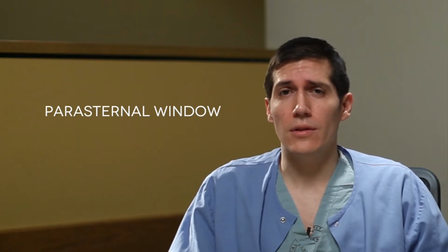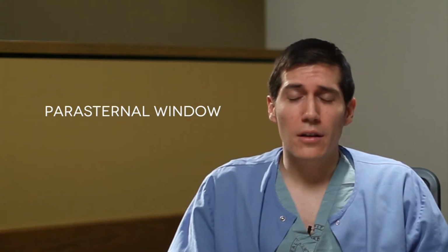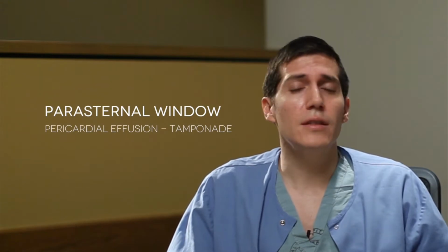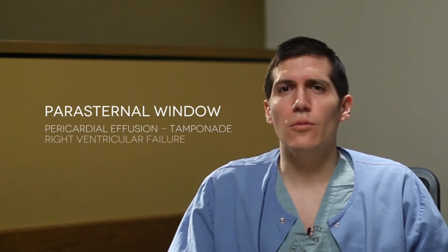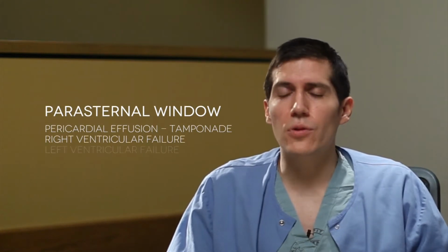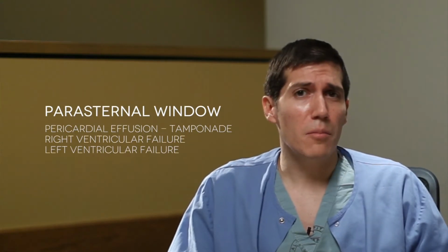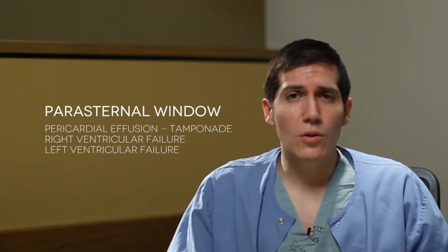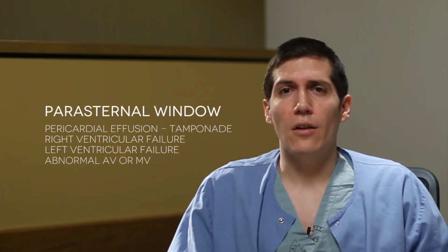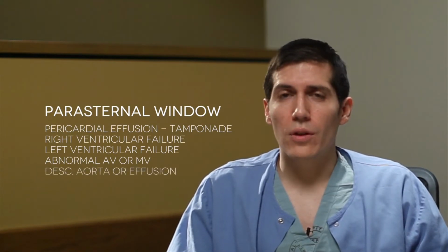to a quick diagnosis. The diagnoses we're considering for an unstable patient in this window would be pericardial effusion leading to tamponade, right ventricular failure with an enlarged right ventricle, both acutely or chronically, left ventricular failure, whether it's an enlarged concentric or eccentric hypertrophy picture or a regional wall motion abnormality, or gross abnormalities of the aortic or mitral valve. You can sometimes even see problems with the descending aorta or even pleural effusion.